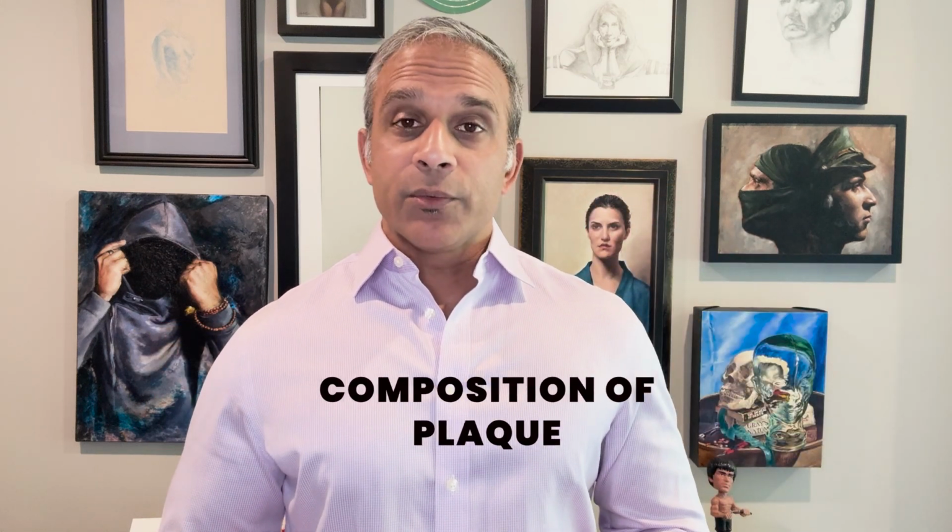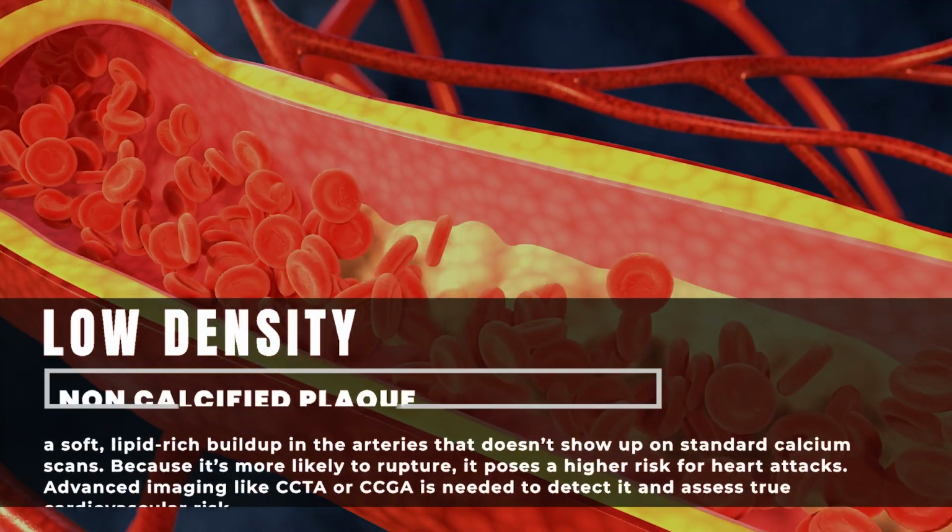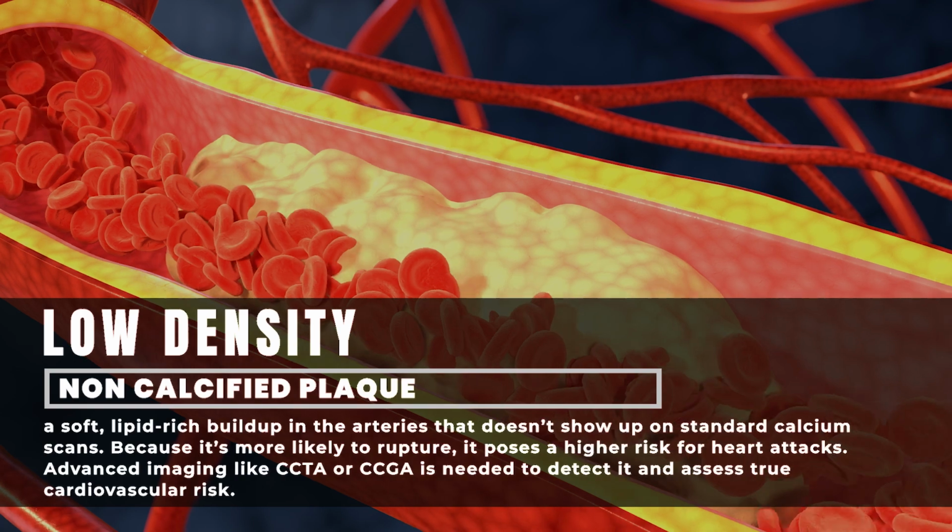We also see the composition of that plaque. We will see the exact amount in cubic millimeters of the plaque, of the cholesterol, and then the low density non-calcified plaque. That's that last category. Low density non-calcified plaque is the dangerous inflamed plaque.